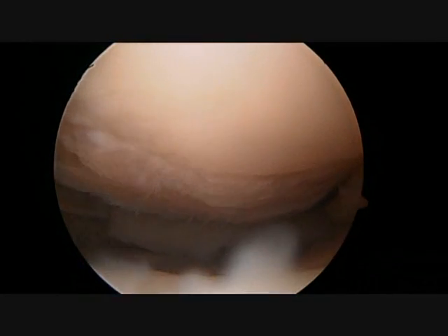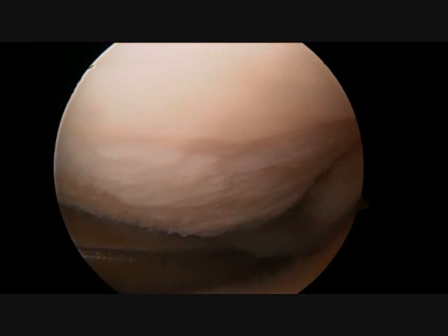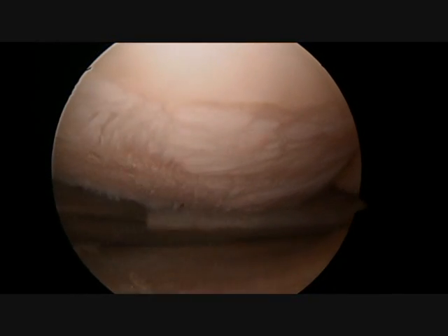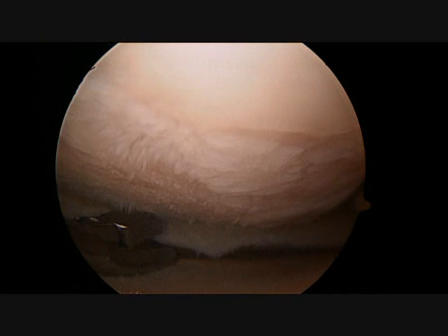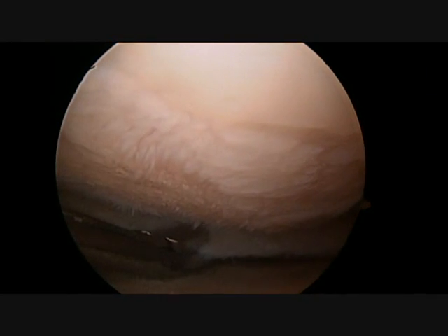The arthroscope is then moved into the medial compartment, which is the most common site for arthritis. Along the way the rough degenerated cartilage can be seen. I like to describe this as looking like an old eastern Carolina country road with lots of loose debris, ruts and potholes.